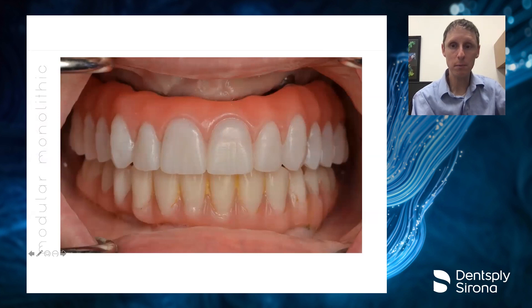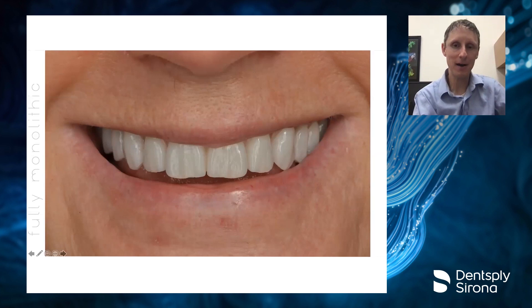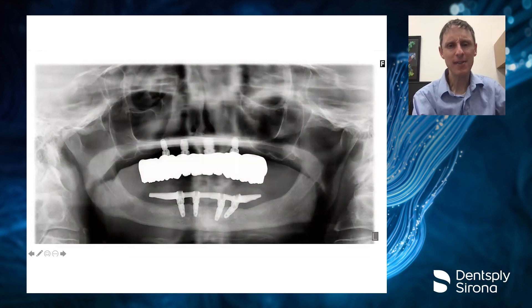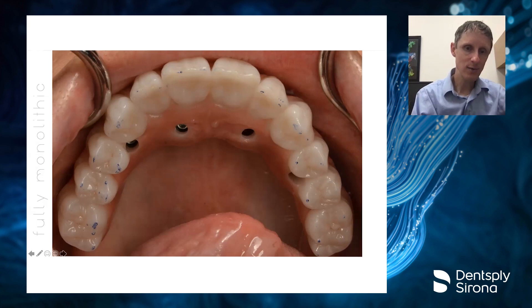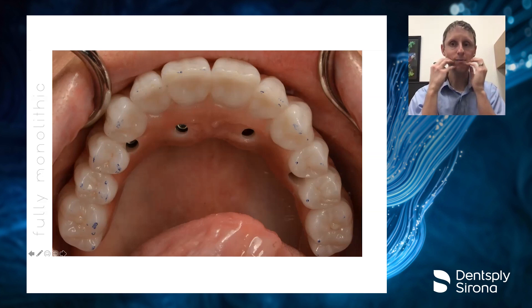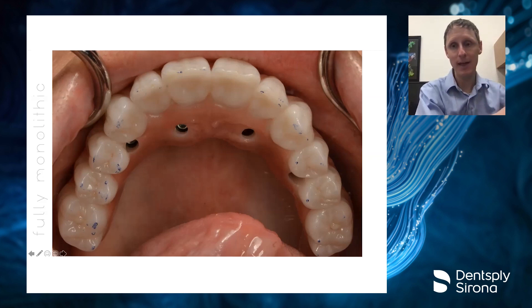Starting with the modular monolithic one — very nice fit. On the x-ray, everything is passive right down onto those multi-unit abutments. When we go to fully monolithic, she just sat there in the mirror looking and was so excited, as most patients tend to be. Again, very nice fit, very nice adaptation, passive fit going down onto the multis. The bite — everything went in passive. She wasn't even hitting on the left side originally, and all I had to do was hit tooth numbers three and five briefly with a burr — about 10 seconds — and she said, 'I'm hitting perfectly on both sides, this feels great.' All done in a digital pathway, no model work, just the scan visit and the delivery visit.